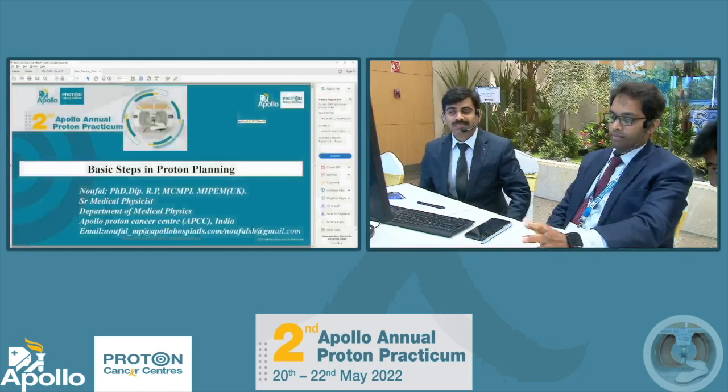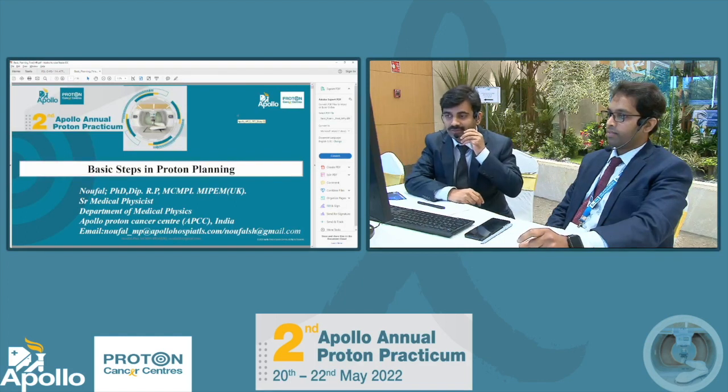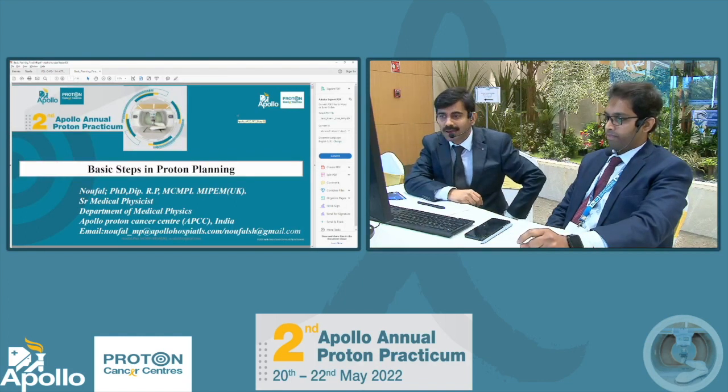So today we are going to show the steps involved in the basic proton planning, and myself, Dr. Naufal, and Nagarjun, he's going to start.